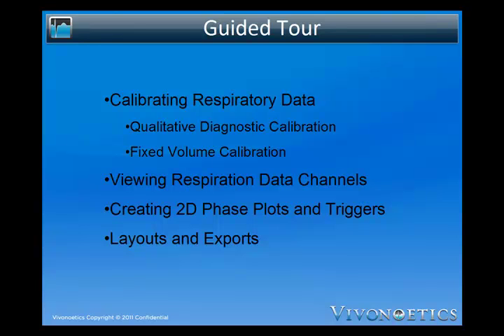We will start by describing the available calibration tools: qualitative diagnostic calibration and fixed volume calibration. Take a tour of the respiratory data channels including respiratory measures and phase relationships between breathing compartments. Create interactive 2D phase plots such as Kono-Mead or flow volume loops with triggers using a few easy clicks, and finish by describing some of the complex respiratory analysis module layouts and exports.